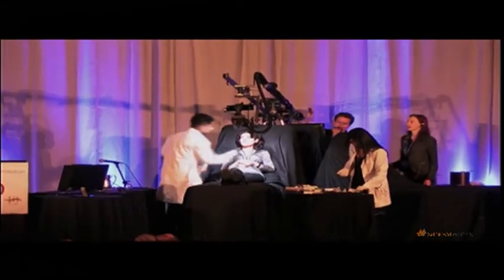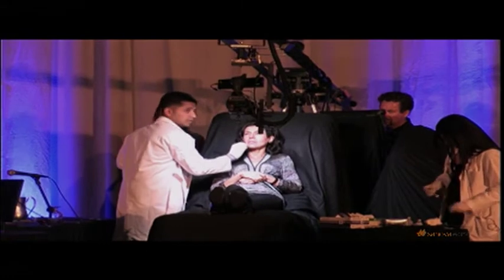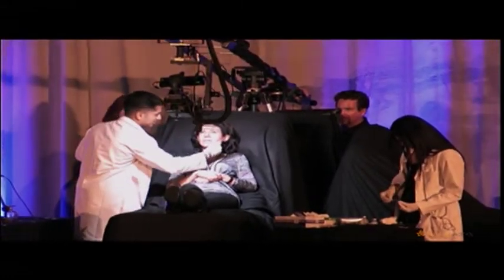to show you some fillers and also some toxin. We're going to be using some Radiesse here. And we're going to be using some Xeomin.